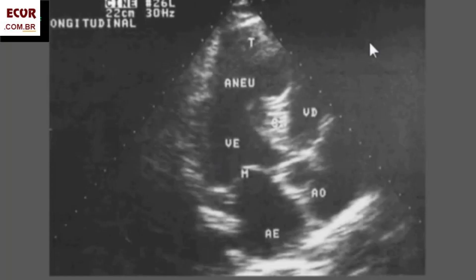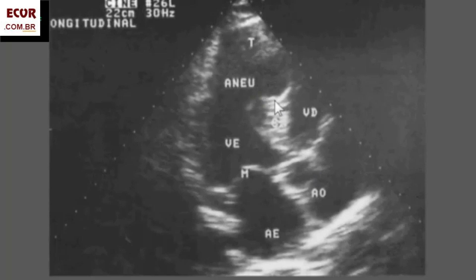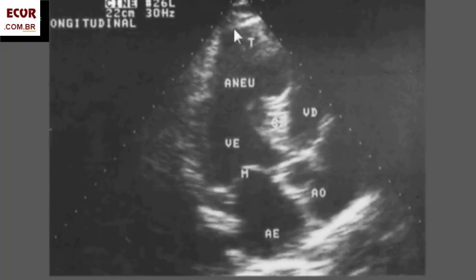Here we have another example — apical long axis view. There's an aneurysm in here. You see here there is a thinning of that wall and it is fibrotic. And it was dyskinetic.